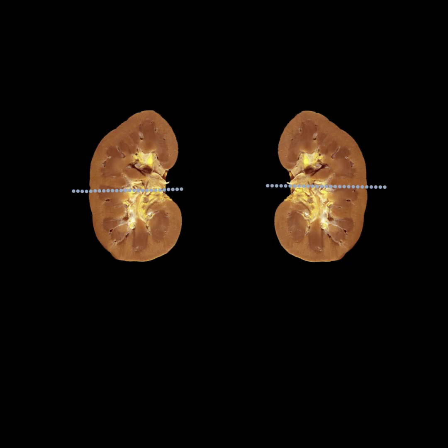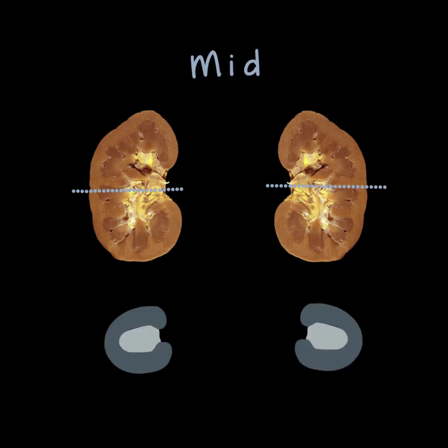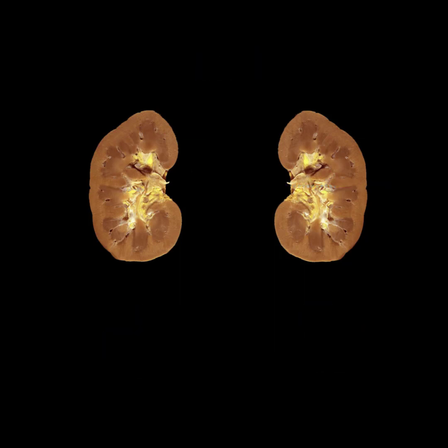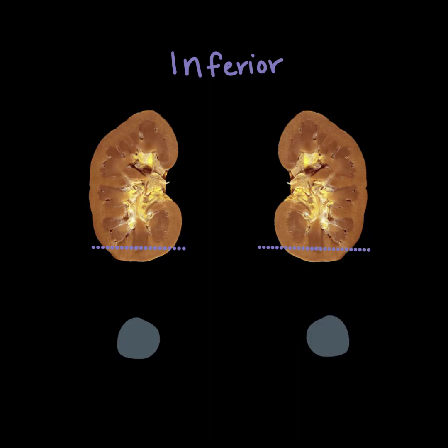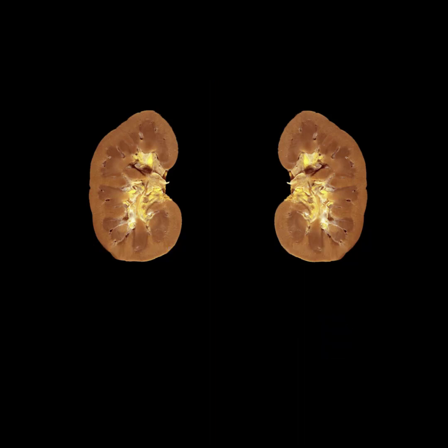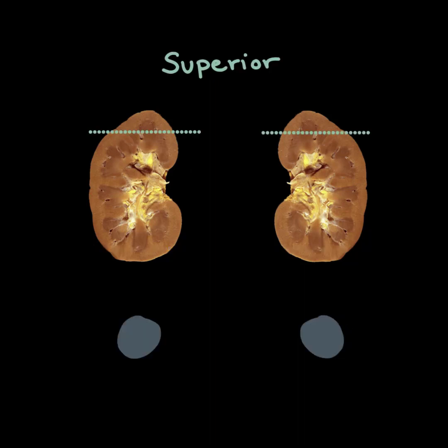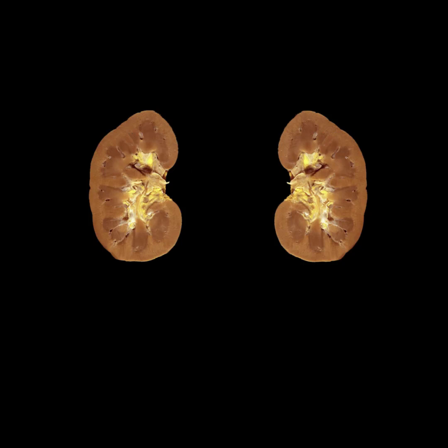The midsection takes on more of a C-shape with the hilum break facing the patient's center. The inferior pole looks very similar to the superior pole but without the liver and spleen. It should be round with little to no renal sinus.